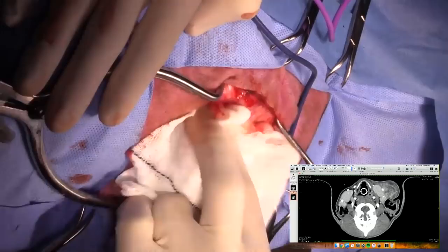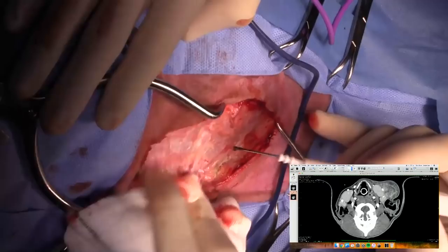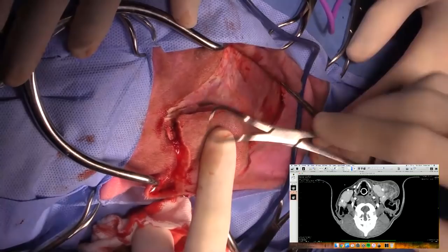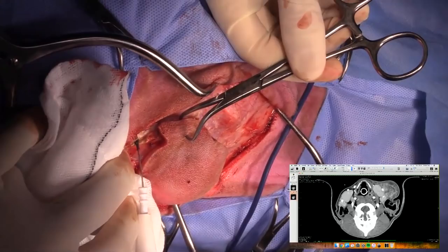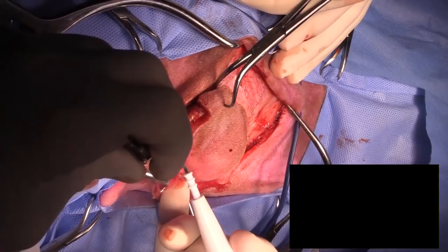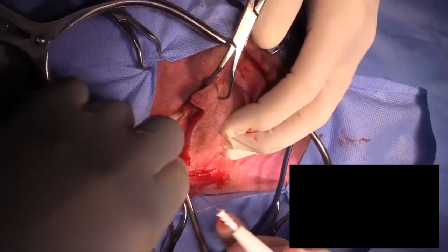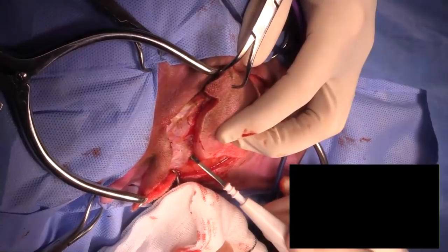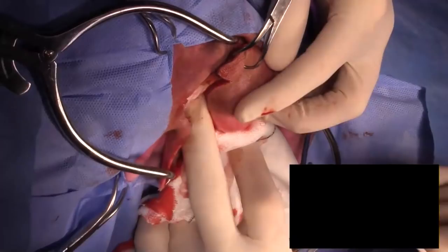There's a question as to whether we saw the foreign body on the CT scan. So that's a really good question. We often get asked that, can we see the foreign body on the CT scan? And generally the answer to that is no. Wood or biological material like a grass seed does not distinguish itself as far as contrast is concerned from the surrounding soft tissue. If you had a metal foreign body, like I had one dog that had a stingray barb embedded in the retropharyngeal region, that showed up beautifully on the CT because it was calcified. But other than that, often we can't see anything. Sometimes we can see wooden skewers. Yep, wooden skewers. We've had a run of a few of them. Kebab sticks that dogs eat because they're yummy.